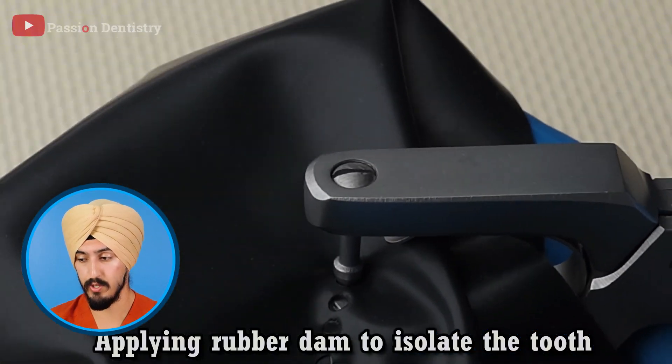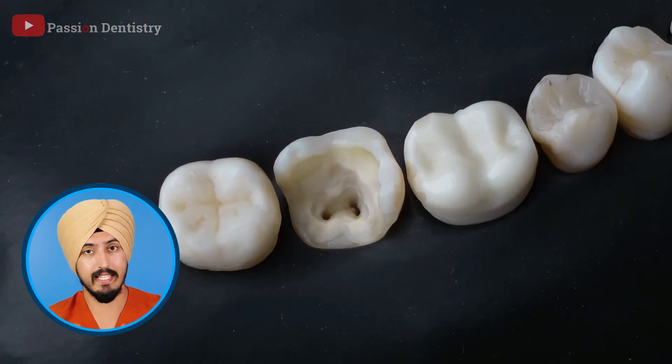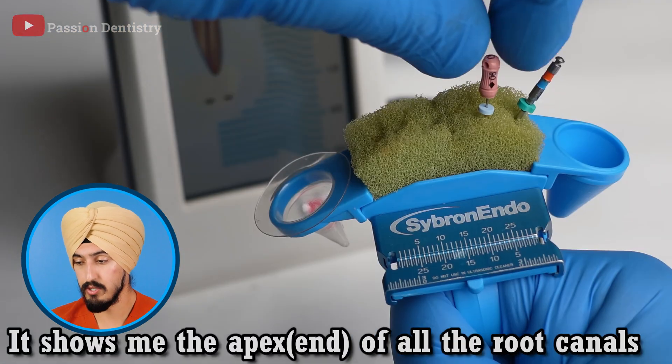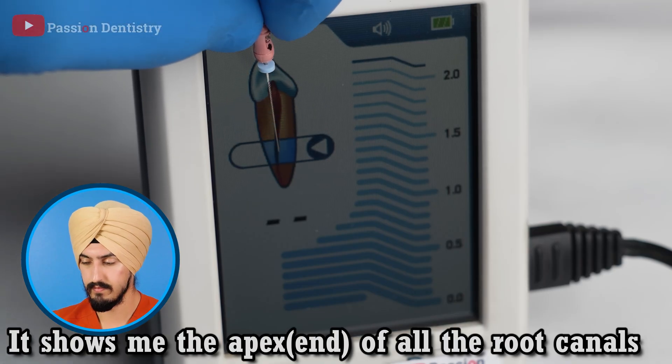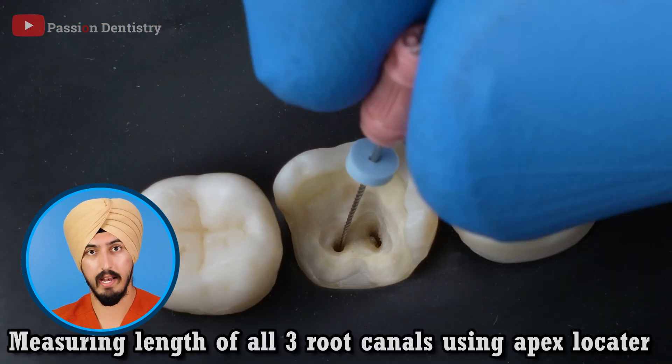So this part is a rubber dam — something to go over the tooth to help isolate it, because it's really important to prevent any bacteria from getting inside that nerve supply or infecting that tooth again. You want to keep it as clean as possible. And now he's doing the actual root canal. This is something called an apex locator — when you get into the canal you want to make sure you don't go too deep and you don't go too short, because you want to clean the whole length of the canal of that root. That apex locator literally tells you how far you are from the tip of the root, preventing you from going too far or too short. He's mimicking what it looks like when he gets close to the actual end of the root.